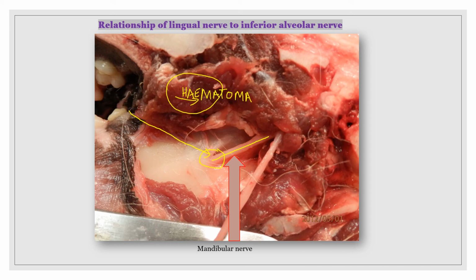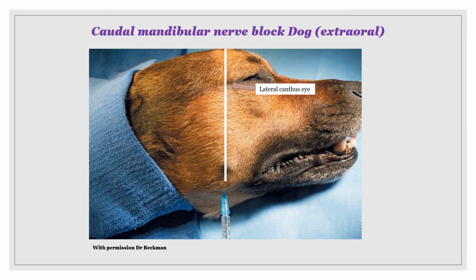If you look at the other nerve, the lingual nerve, you can see it here, running here. You can see that the branch is just a little bit dorsal caudal in this area. That's where the branching will be. So if our injection is in this area here, we may not pick up the lingual nerve, but if we give enough volume, you'll infiltrate some of the anesthetic agent to the nerve.